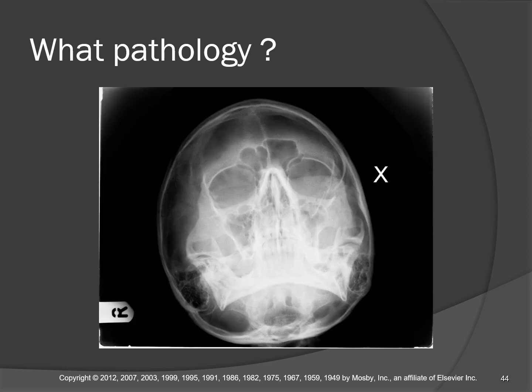Right, with pathology, now this looks like a Waters projection. I don't think you've had the skull unit yet, and so you don't know what this sign is. But it's actually a sign for an orbital blowout fracture. We've got a little teardrop in the left maxillary sinus, okay? And so right underneath the orbit on the left side, there's an extra couple lines there that you don't see on the right maxillary sinus.